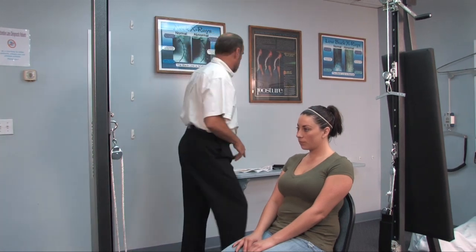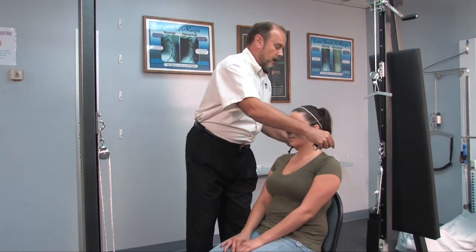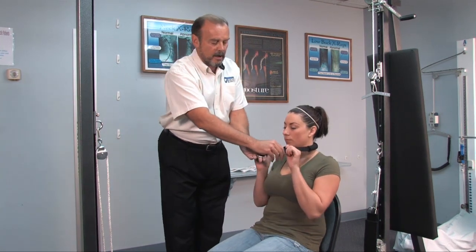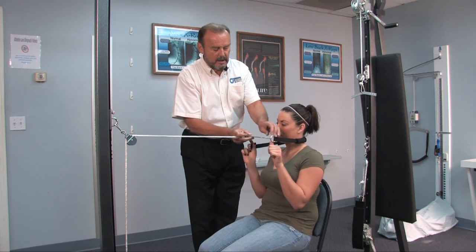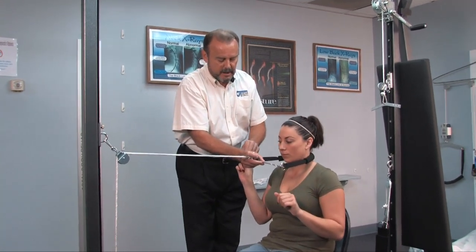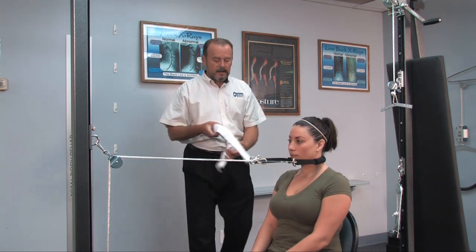We're going to place a second one on the front one right there. Next, we're going to go ahead and place the cervical sling behind her neck and simply hook up — we'll hook up on one side and hook up the other side. And now we're going to take the head halter.